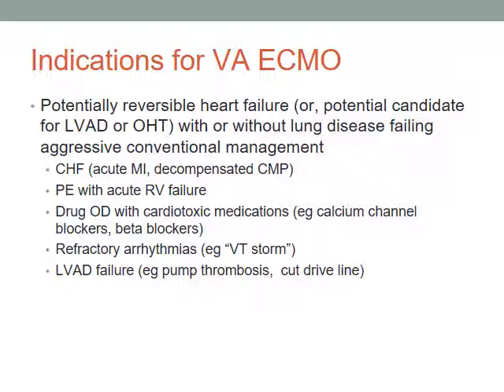That'd be F. Okay, so conditions that might be reasonable to do: congestive heart failure, acute MI, decompensated cardiomyopathy, PE with acute RV failure, drug overdose with cardiotoxic medications such as calcium channel blockers or beta blockers, refractory arrhythmias, VT storm, LVAD failure, such as pump thrombosis or somebody takes scissors to the driveline.